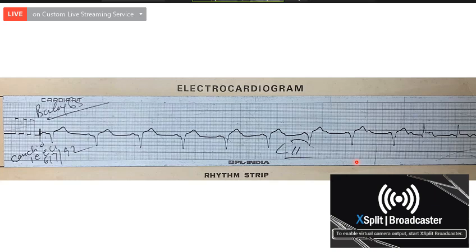So can this be a complete heart block? Probably, sir. How will you diagnose complete heart block? Criteria? PP interval should be equal and RR interval should be equal. Very good. And AV dissociation should be there. Very good. PR interval should go on changing. And one more point. P rate will be? V rate will be less than atrial rate. Or rather, P will be more than QRS complexes.